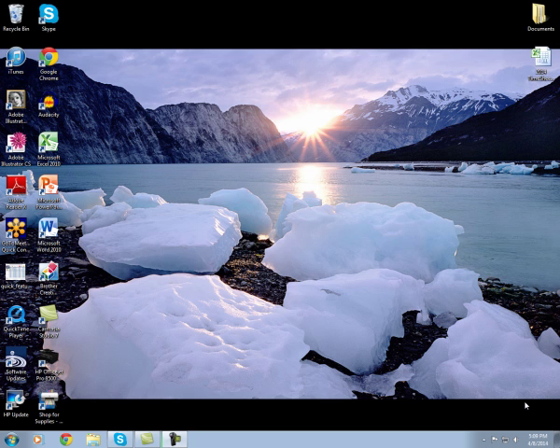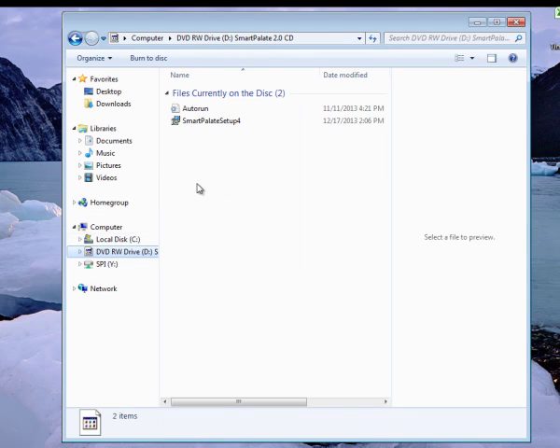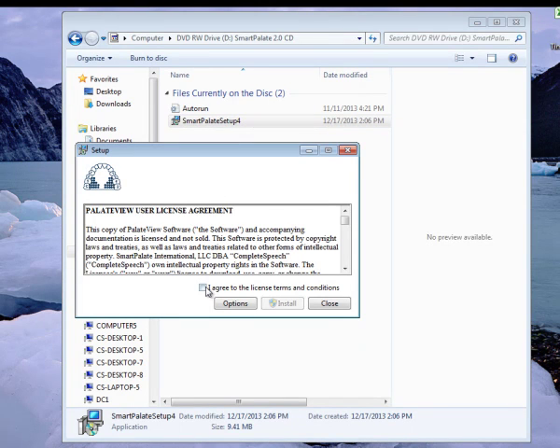Let's start with the installation. The SmartPalette 2.0 software is compatible with Windows 7 and Windows 8. You will need a minimum of 4GB RAM and adequate processing speed to run the software. When you first put in the CD, the autoplay should appear to launch your installation wizard. If not, you'll need to navigate to your CD or DVD drive files and double click the SmartPalette Setup to launch your installation wizard.